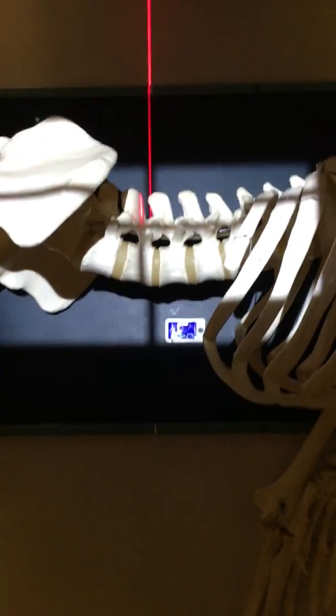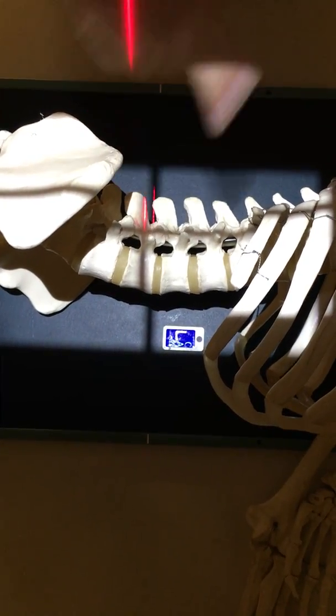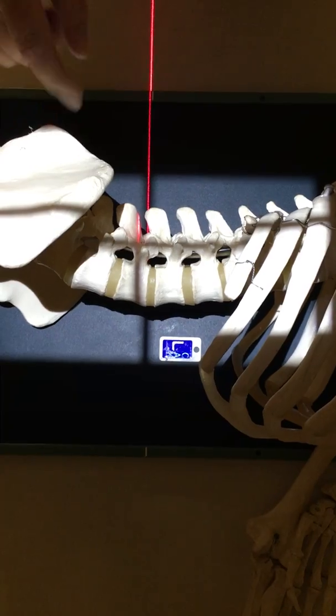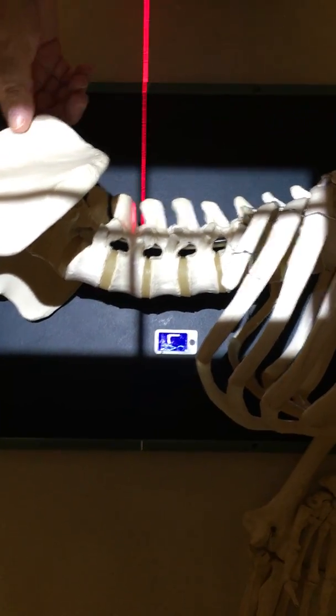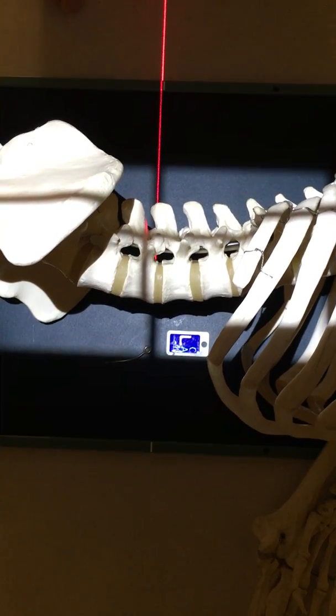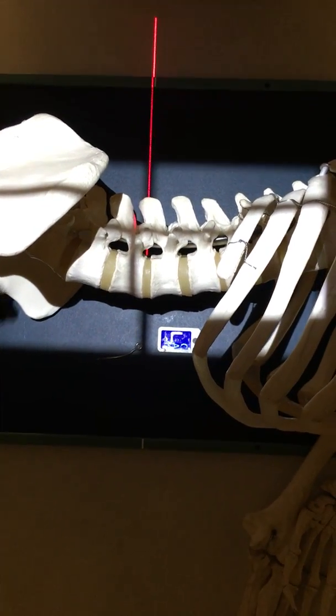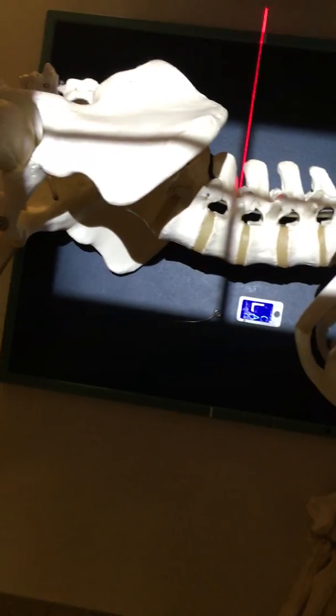Now, make sure when you're doing the lateral that you find the top of the crest and you center an inch to an inch and a half above the top of the iliac crest, which is what I have here, which is actually at approximately the middle of L3. So, as you can see, the collimated border includes plenty of anatomy.